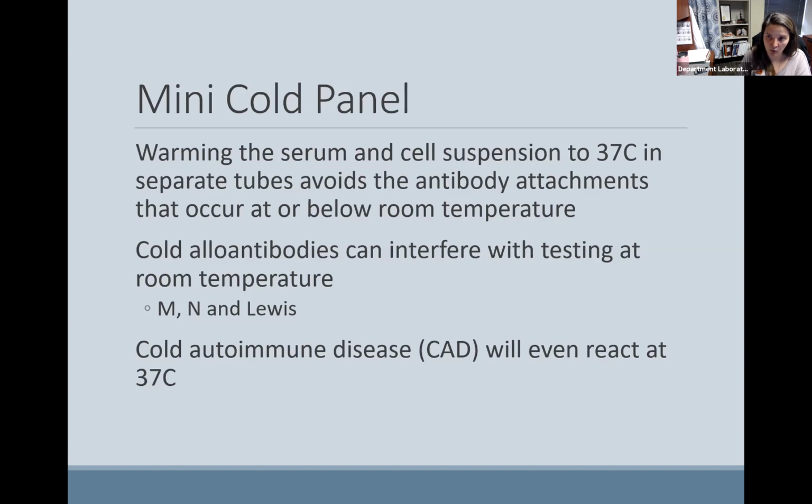Anti-M is known to interfere with our back types as well as react at 37 and AHG phase of testing. When anti-M is reacting at AHG, it is considered clinically significant. So we want to make sure that we do AHG phase of cross-matching.